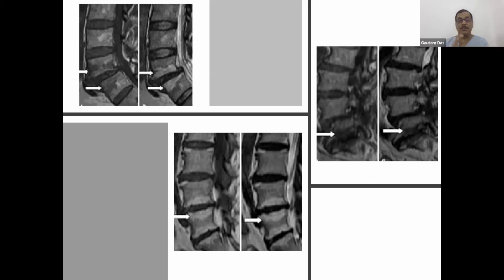Just listen to me. In T1, what will be looking white? Just remember this like a mantra. In T1, fat and adipose tissue will look white, and the structures where there is no fat will look black. A little bit of fat means some gray. More fat, more white. Less fat, less white. That is in T1. And in T2, water is white.